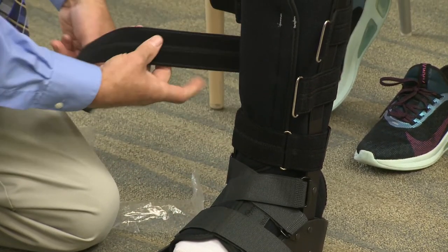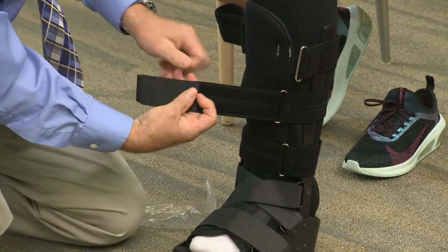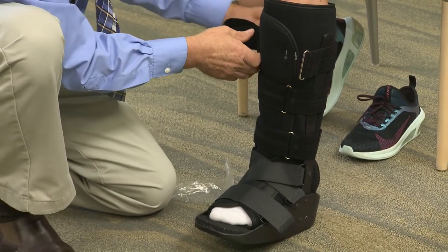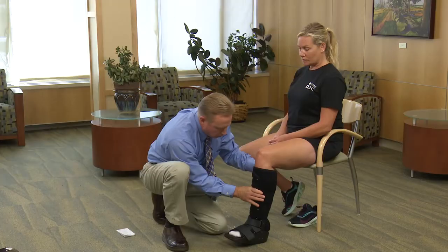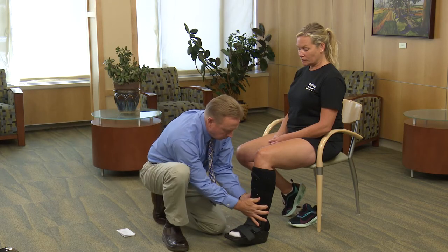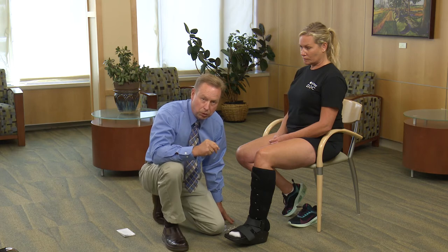Patients, you should not have to adjust the location of these straps whatsoever — they should be stuck to where they were originally placed by your provider. Make sure you clearly understand your weight-bearing status. Some of you may be non-weight-bearing entirely for some period of time. Some of you may be allowed to walk in your boot. Make sure you understand that before you leave the office.